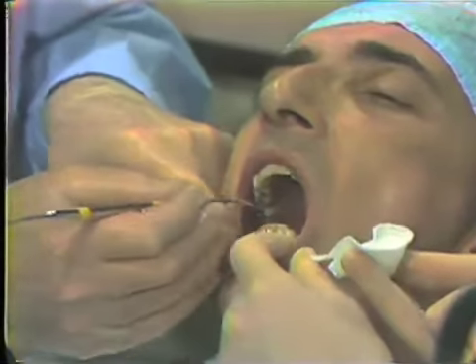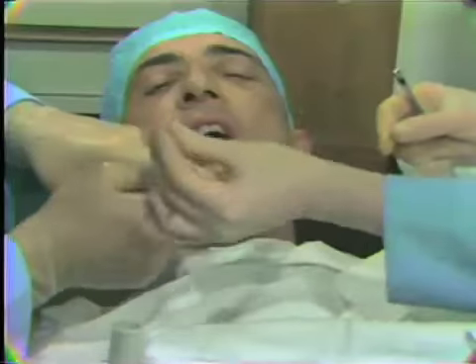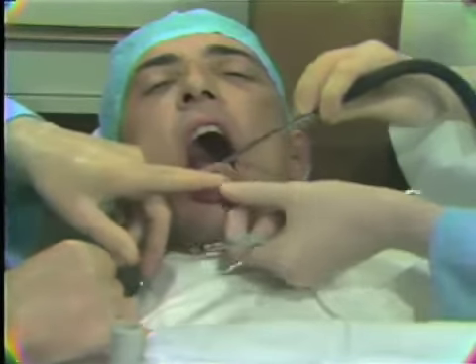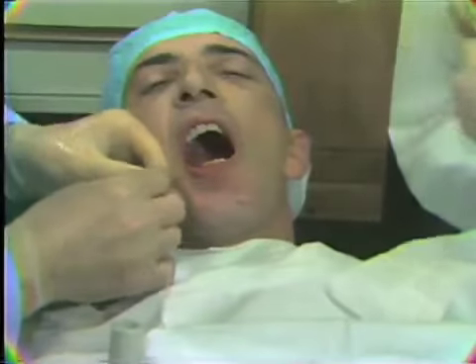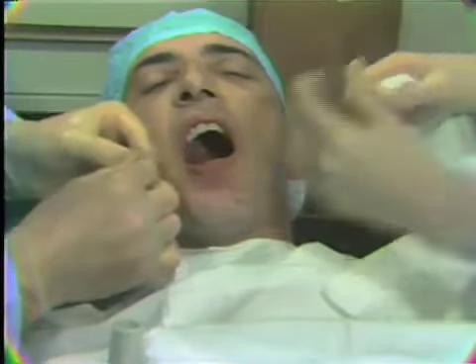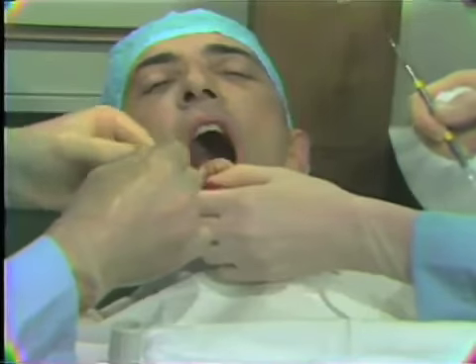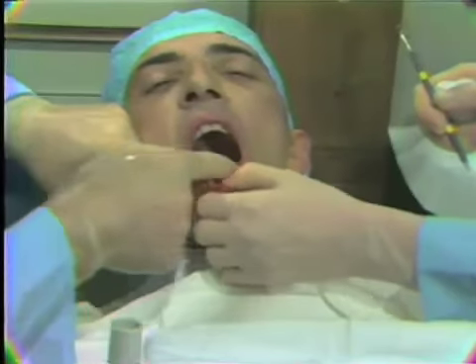Now we need a piece of dressing for the labial aspect. Can you give me some aspiration in this labial area? We again visualize the surgical site while the assistant again retracts the lip. We're able to see reasonably well and estimate the amount of dressing that we need to place into the area.